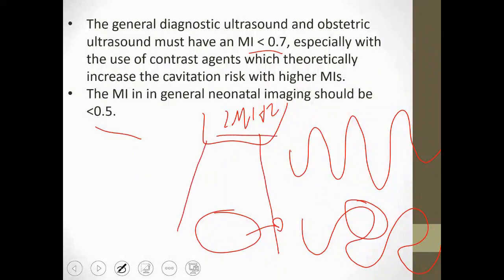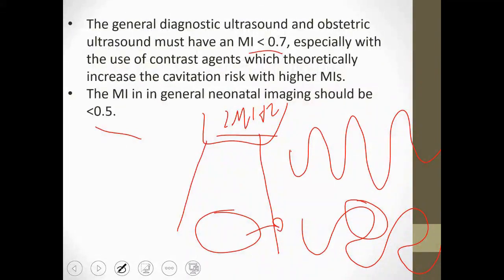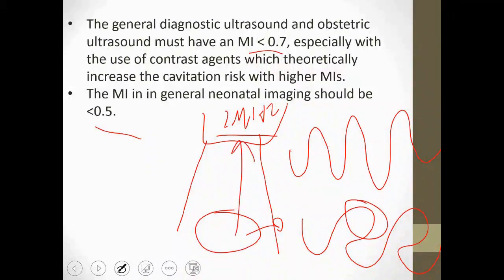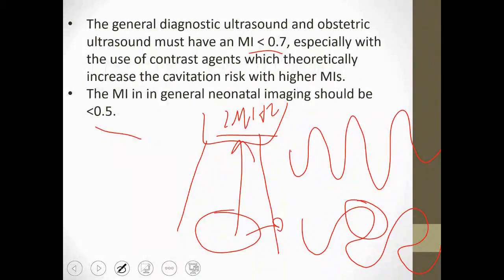The tissue itself sends a pulse at a frequency distinctly different from the fundamental frequency you initially sent. You originally sent a fundamental frequency of 2 megahertz with a certain intensity, and as it travels towards the tissue, the signal gradually weakens as it returns after reflection.